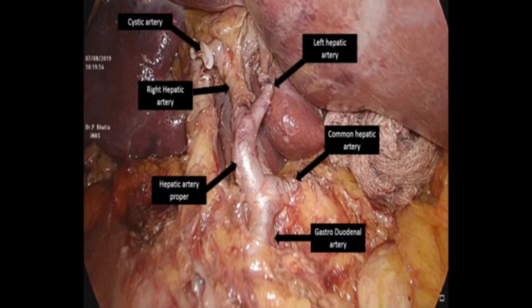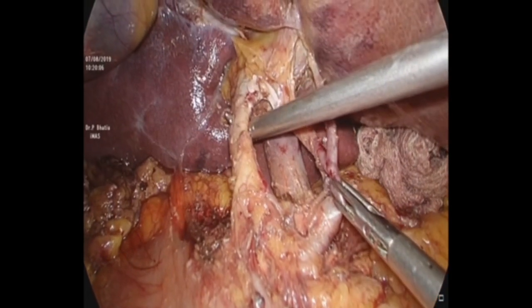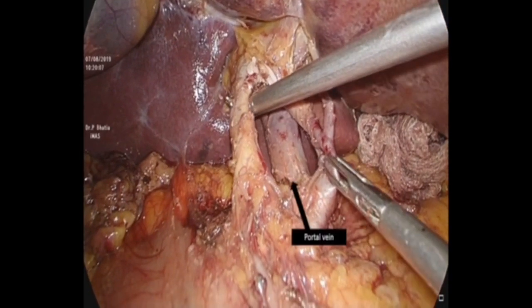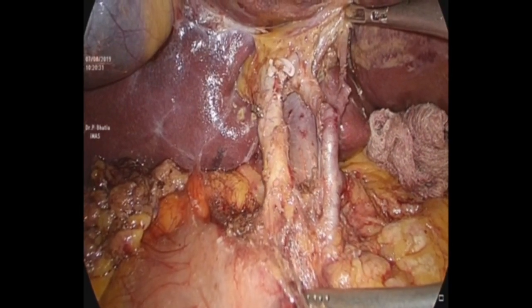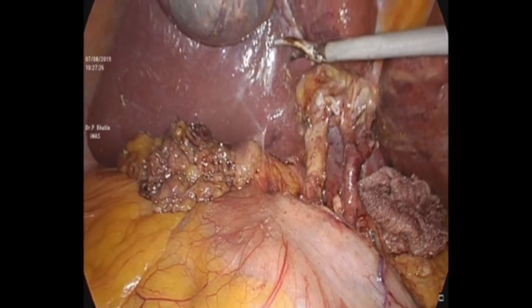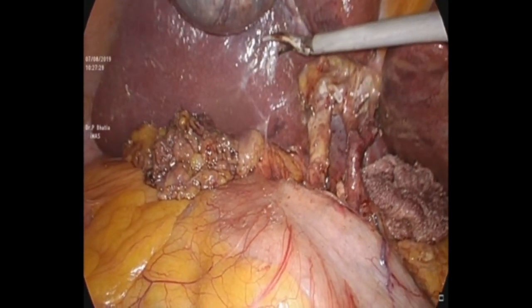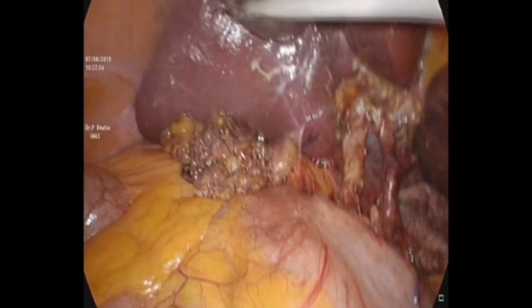We can appreciate the anatomy well: common hepatic artery, hepatic artery proper, left hepatic artery, right hepatic artery, and the cystic artery has been clipped. The next step, after delineation of the anatomy, is to resect the liver by 2cm all around the gallbladder fossa. First, we do the scoring with the Harmonic HD, scoring 2cm away from the gallbladder fossa.